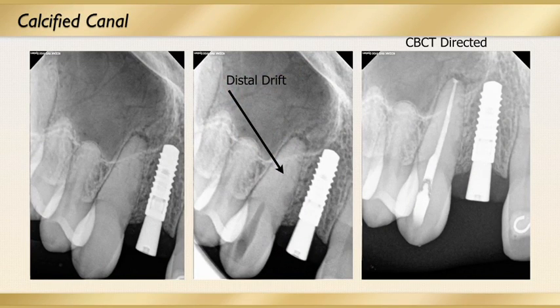I was very happy just to find the canal. Here's another trauma case of a young patient, a college student, and the same thing occurred on this canine. Very calcified canal. I was distal, you can see my distal drift. I could not find the canal.